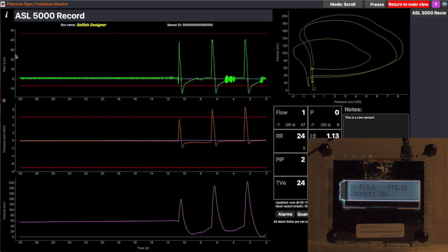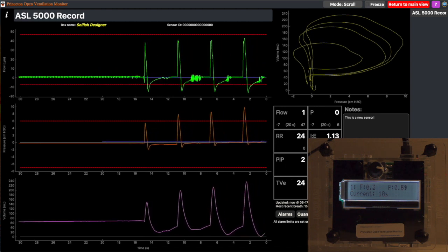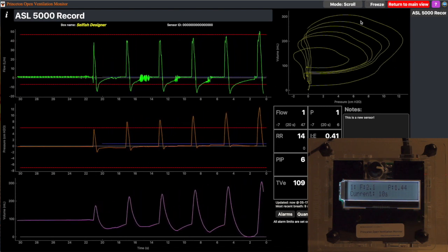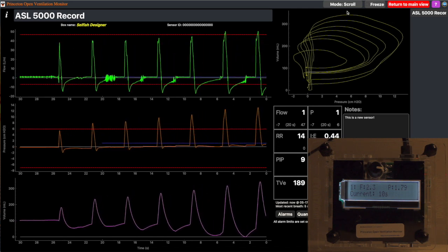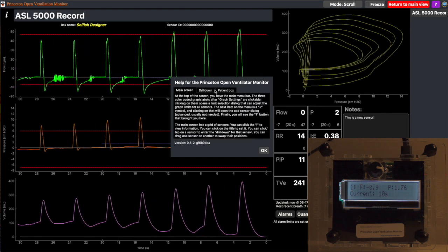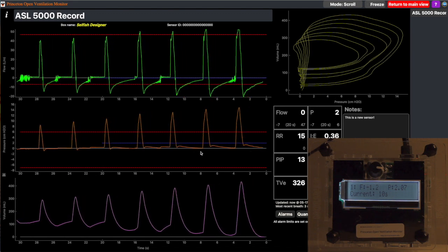This is a screen that shows more information about an individual device. You can just scale there. This is all of the measured quantities. We can bring up more information. We can freeze this if we want, just by clicking here, release it. Some modes and things. There's also a list on the far right of the different devices that you have. There's help here. You can look through the different help dialogues and just click anywhere to close.